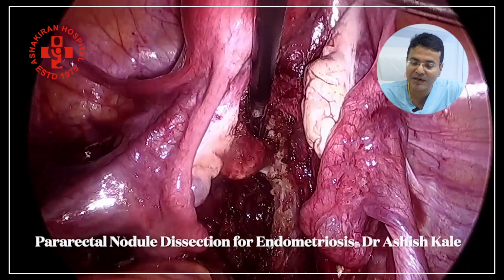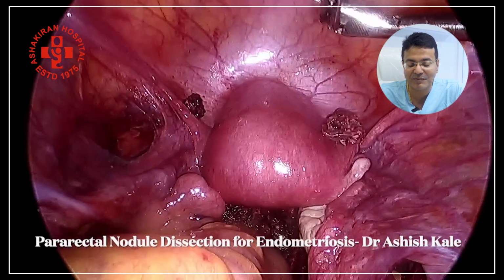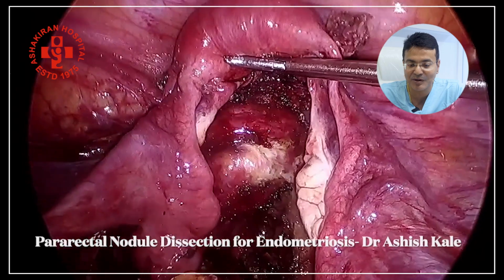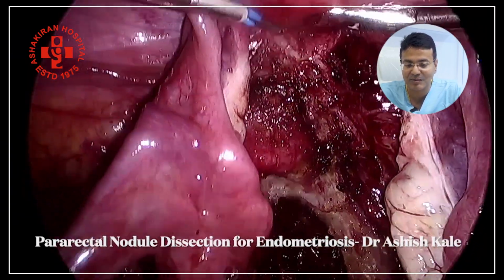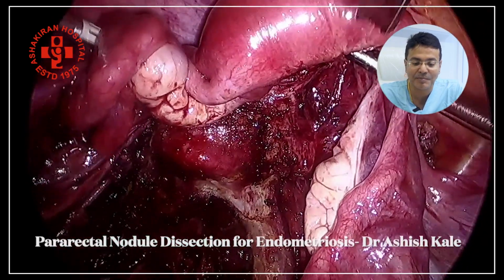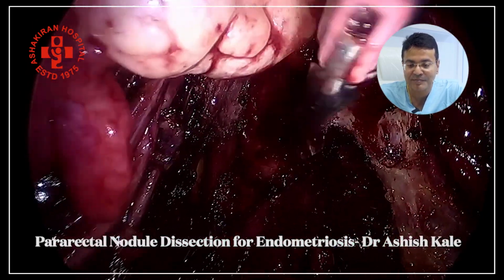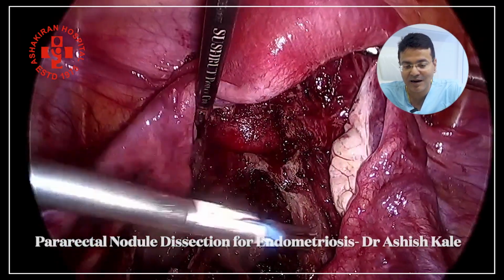On the right side of the patient, the uterosacral and everything is done. This is the posterior fornix where an assistant's finger is there, and now the dissection is cleared off from the rectum. You can see the rectum which is very much below, and this is the finger in the pouch of Douglas or the posterior fornix of the patient, and the uterosacral is taken care of. On the right side and the left side, the pararectal nodule is already dissected. Unfortunately, we did not have the videos at that particular time, and you can see the bilateral ureters are very much there and intact.